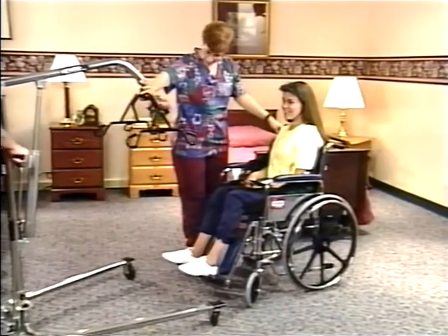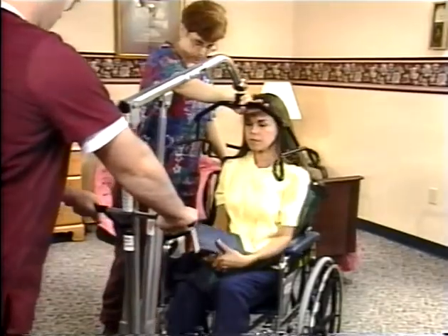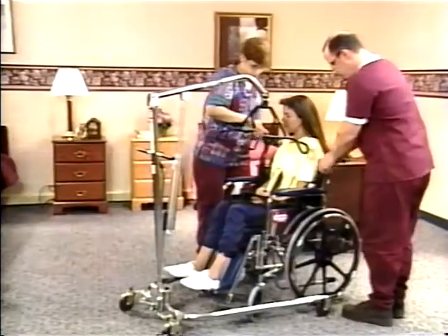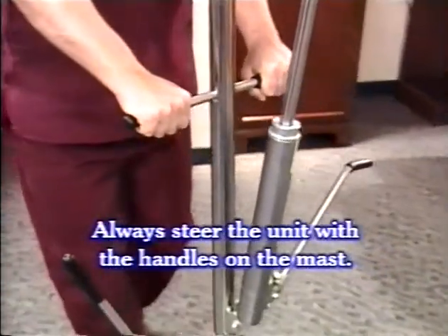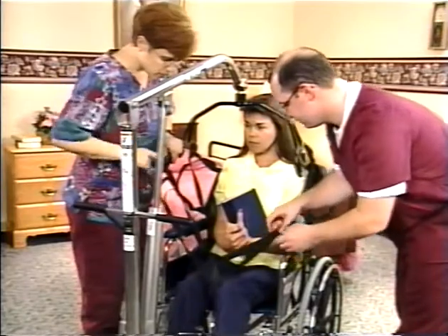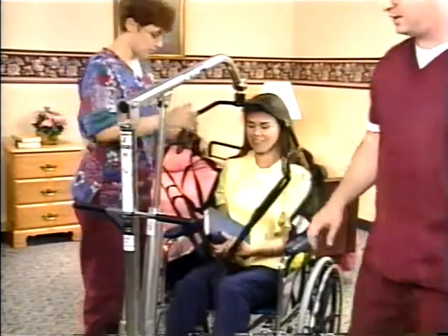Raise the cradle slightly to make sure she has enough headroom. Using the steering handles, carefully position the lifter in front of the chair with your resident straddling the mast. Remember, never push or pull on the boom or the sling. Always steer the unit with the handles on the mast. Make sure the footrests are in the upright position and raise the lifter until she is just clear of the chair.